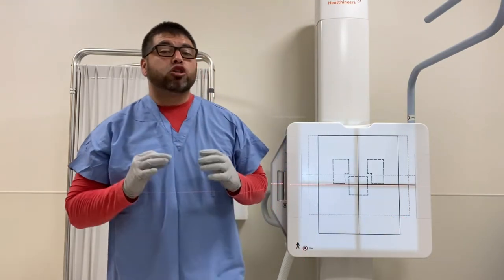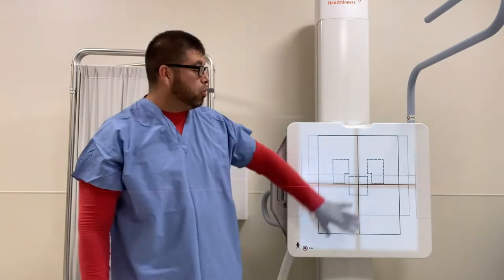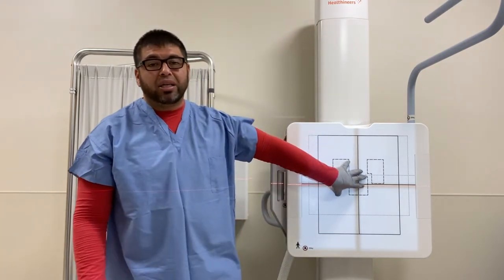You can make it small, you can open it — whatever the case may be. So basically, it's very, very important that you collimate to the proper body part that you're doing. So if you're doing the chest, you want to open wide so you can get all the anatomy you need, and it gives the proper penetration, the proper radiation dose for that particular body part.